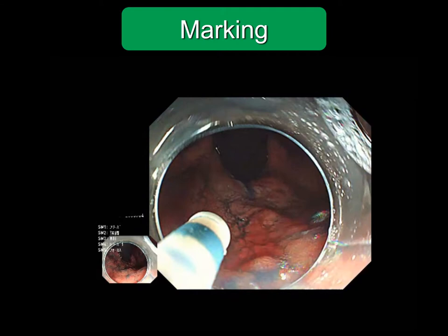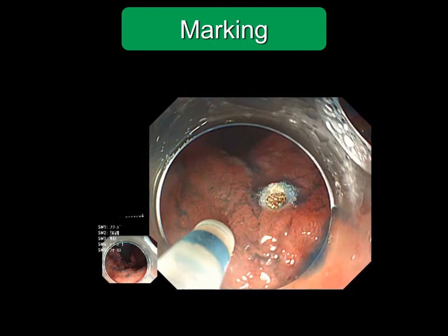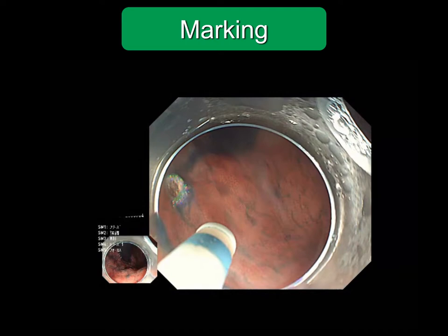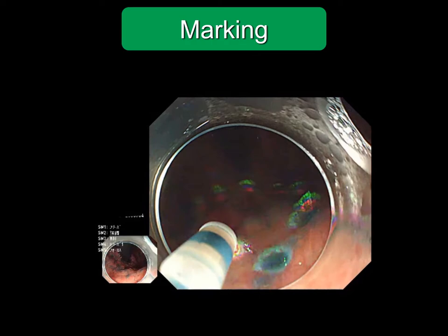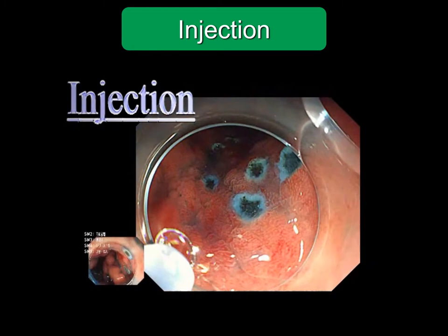In the stomach, I apply markings at 3–5 mm from the boundary of the region. In the esophagus, it is better not to widen the marking, because stricture after ESD is problematic. Since the border is clear in regions of the colon, colonic ESD is basically performed without marking.